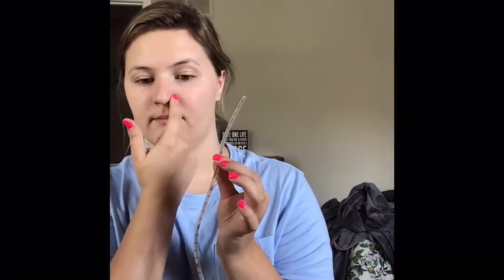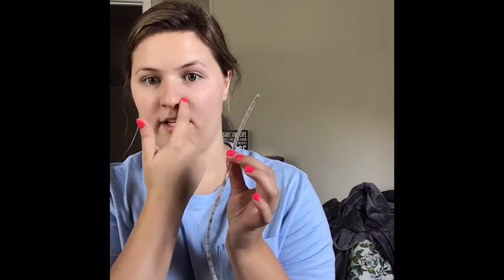And so I'm going to have my patient up at about 90 degrees. When I put it in, your patient's going to go back anyways, it's just natural, like someone is sticking something up their nose, and it's actually good that they're back a little bit. So I'm going to start with my left naris, because that's where I measured. I'm going to go up, and start going back.